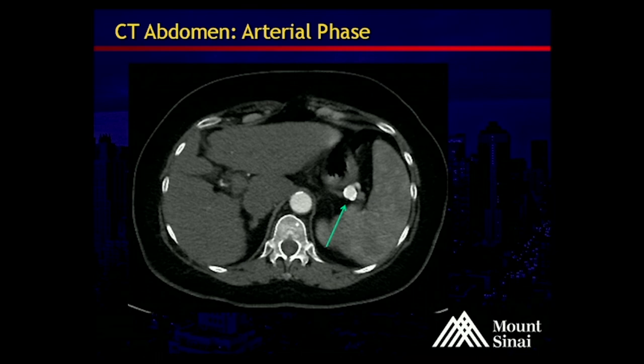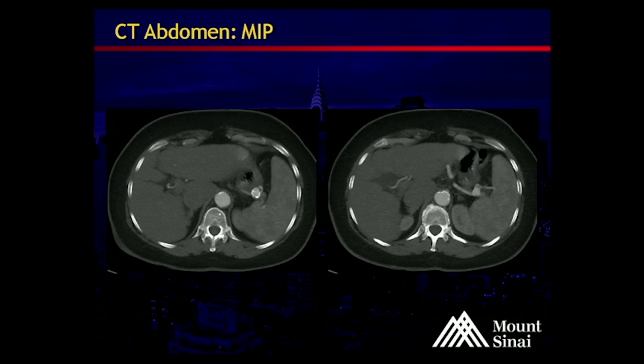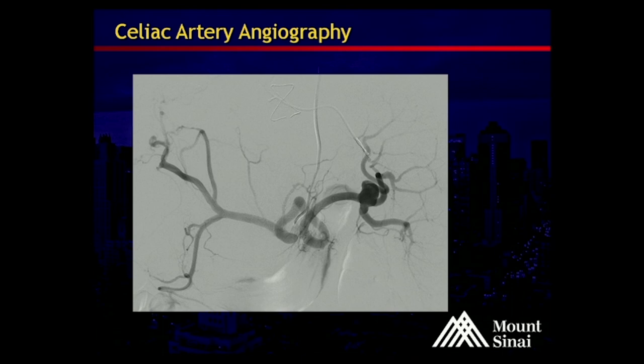This CT image demonstrates the splenic aneurysm, which is partially calcified and quite sizable compared to her aorta. A MIP reconstruction from that CT data shows the splenic aneurysm is actually at the hilum with multiple vessels originating from the aneurysm itself. This angiogram from one of the chemoembolizations also nicely demonstrates the aneurysm at the hilum with multiple vessels originating from it.